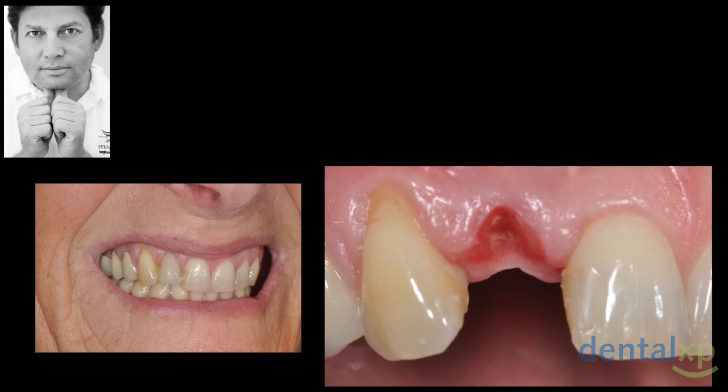So you can see, I chose for you a high smile case, a patient who has a gummy smile. What happened, I made a Maryland bridge. I told you this is all delayed. I try to avoid immediate restoration because that's easy and looks good and predictable. We want to make it delayed so we can see we have the same problem. And the Maryland bridge came loose. She went to a colleague and he put a lot of composite and the papilla was gone. But by thickening, by boosting this soft tissue, this will come back.